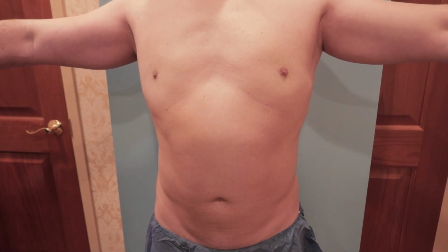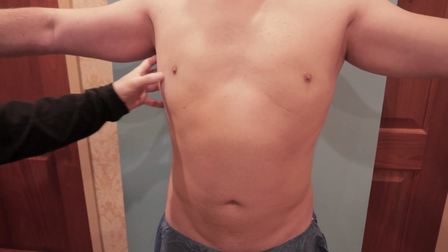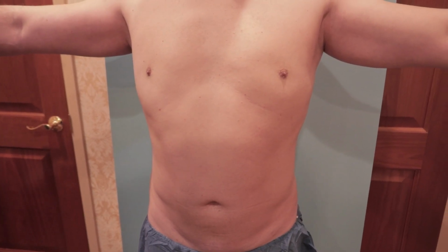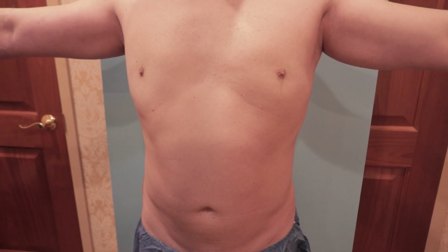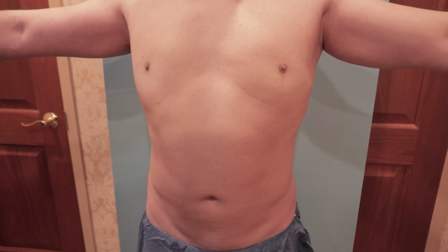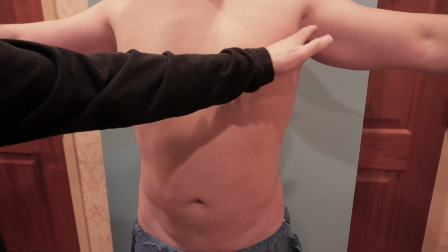Really do not have to explore underneath there. You can see the incision, not that bad. But what bothers him is all this junk. He says, yeah, the doc took out the glands, but didn't really shape me. And it's really about definition, high definition, muscle movement, and athletic lights and shadows. So we're doing it all from neck to nuts. We're going to etch the pectoralis major muscle.